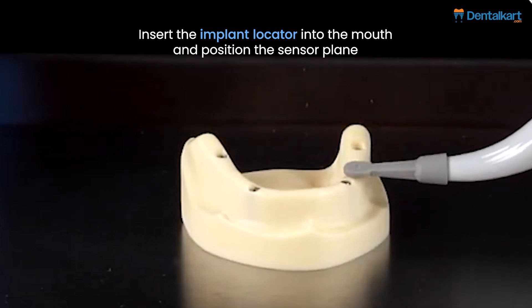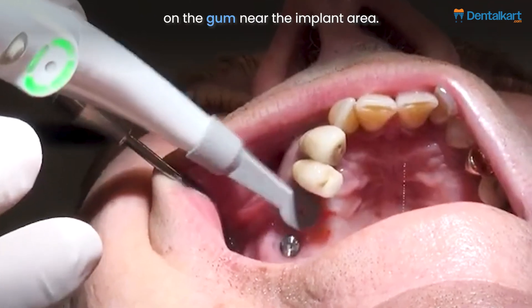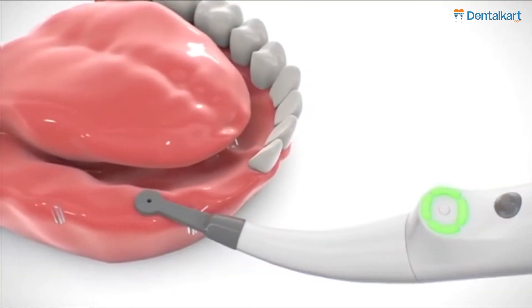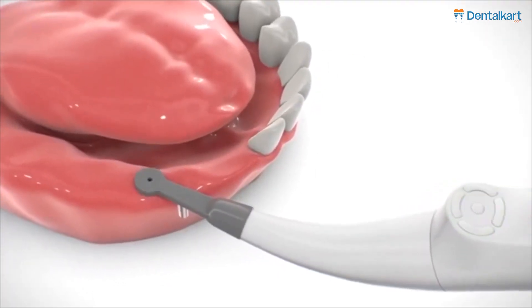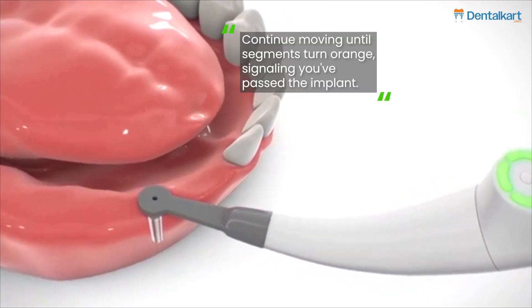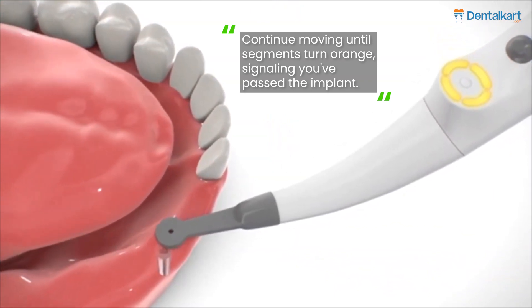Implant locator usage instructions: insert the implant locator into the mouth and position the sensor plane on the gum near the implant area. Align the sensor's central hole with the jaw ridge and move it slowly toward the implant. Watch for four steady green segments indicating proximity to the implant. Continue moving until segments turn orange, signalling you've passed the implant.